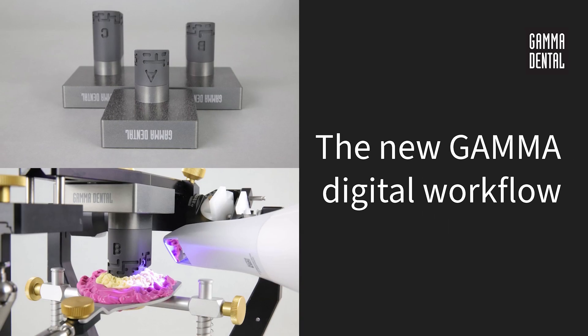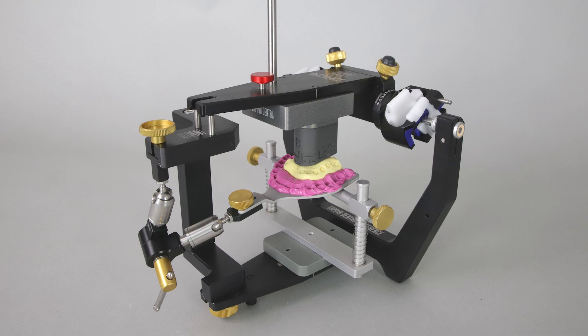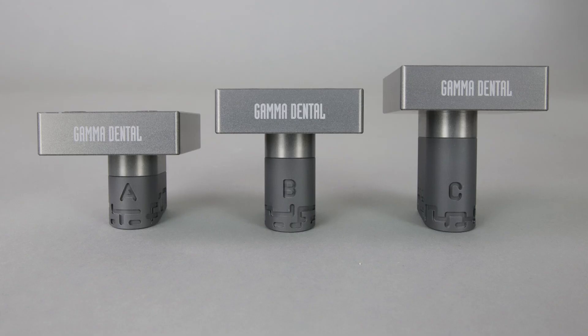Hello and welcome to this Gamma tutorial. Today we will introduce our brand new Gamma digital workflow. The Gamma digital transfer blocks are required. The digital transfer block set comprises three individual digital transfer blocks of different heights, labeled A, B, and C.